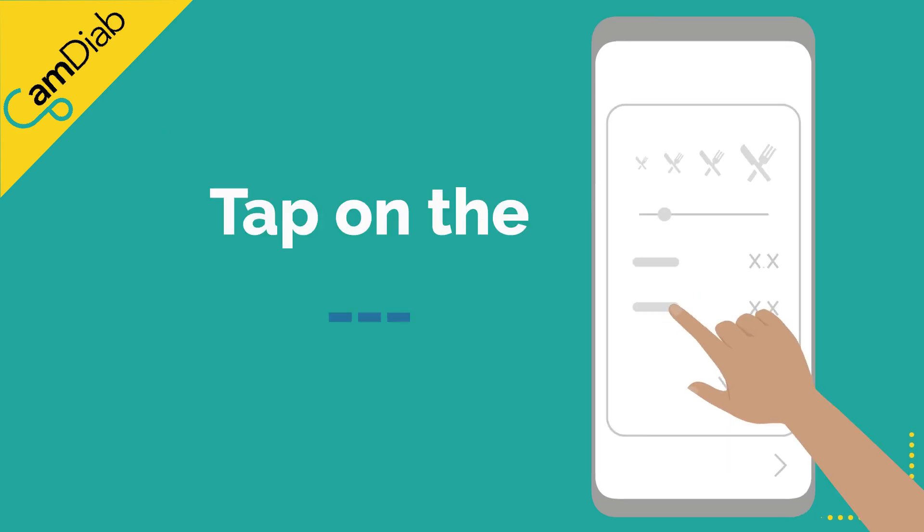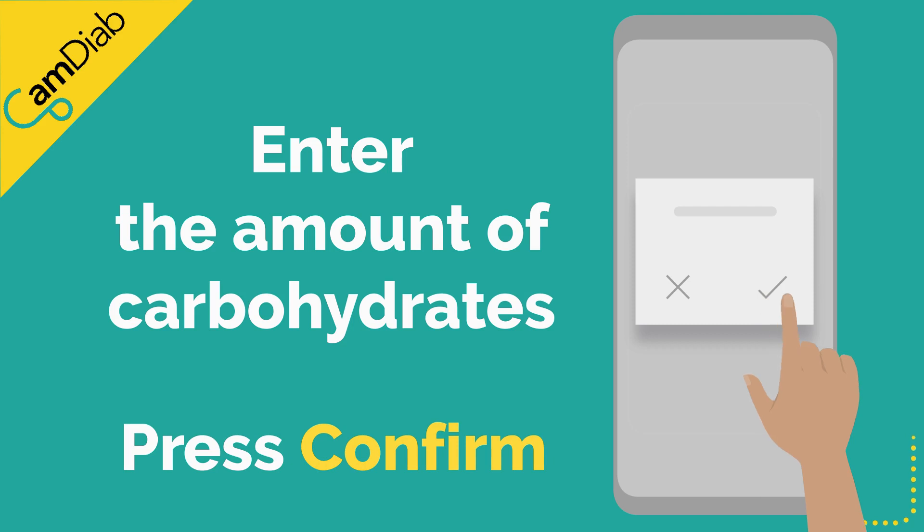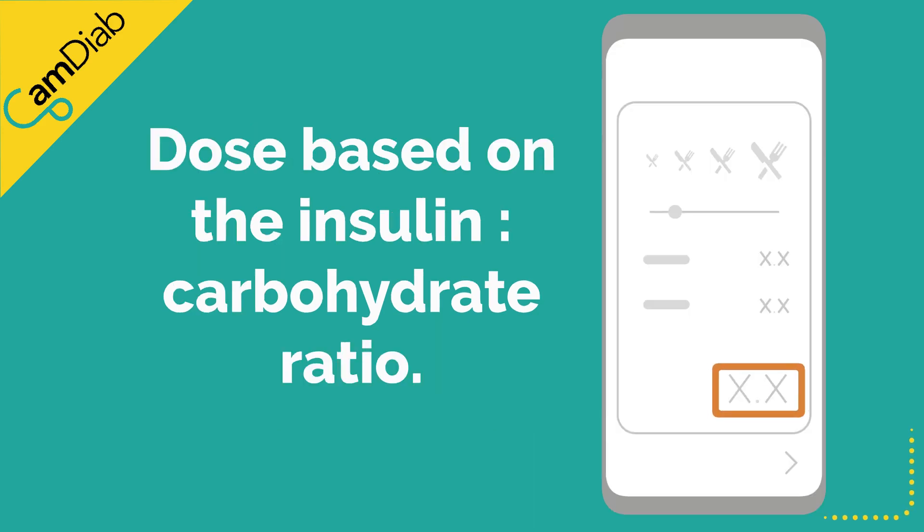Tap on the three blue lines. Use the keypad to enter the amount of carbohydrates about to be consumed. Press confirm. A dose of insulin will be offered based on the pre-set insulin-to-carbohydrate ratio at that time of day.